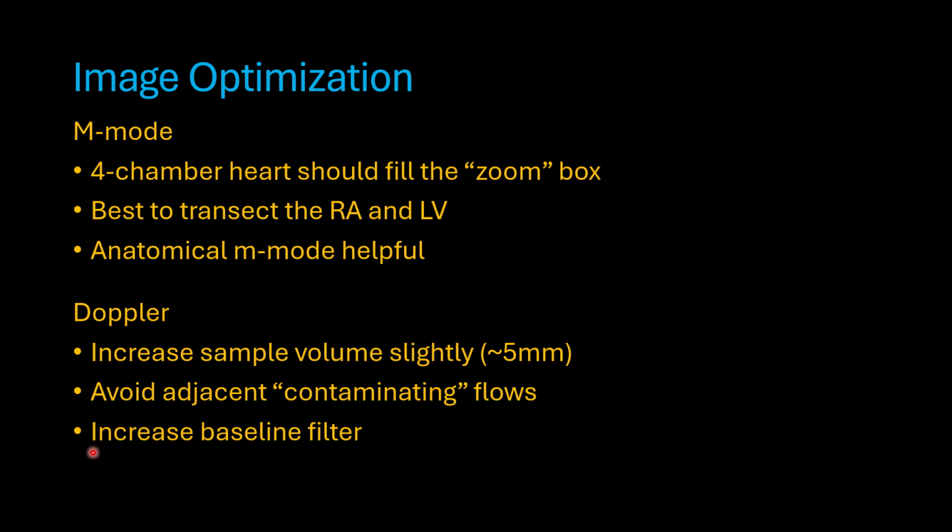And that brings you to the increasing of baseline filter. You want to make sure that you increase that filter so that you filter out some of those contaminating flows that are in the periphery.